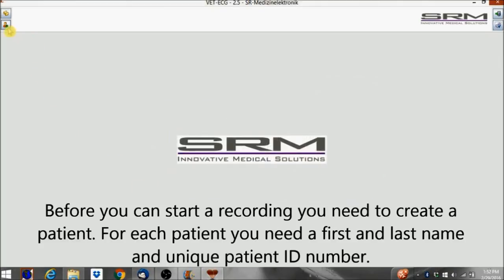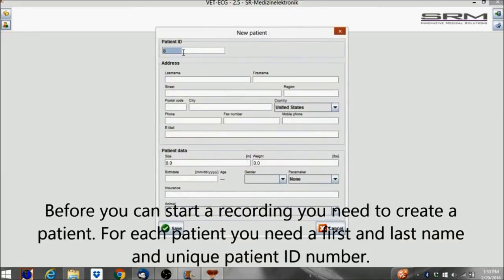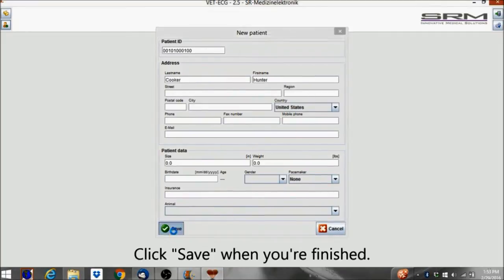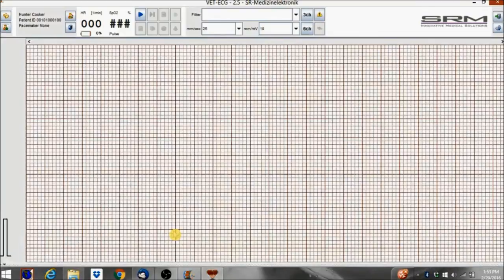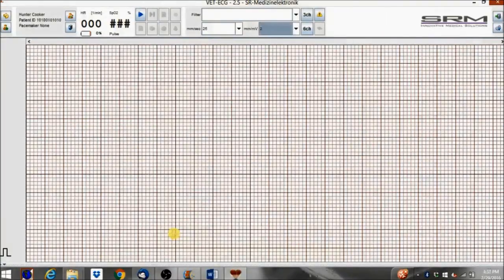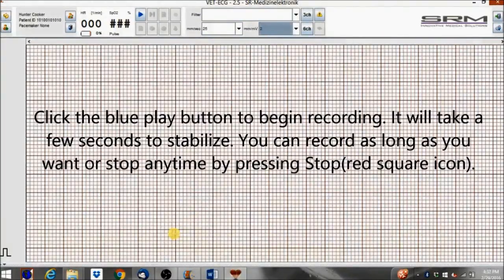Before you can start a recording, you need to create a patient. For each patient, you need a first and last name and a unique patient ID number. Click Save when you're finished. If you haven't done so already, now is the time to attach the lead cables to the patient. Click the blue Play button to begin recording.